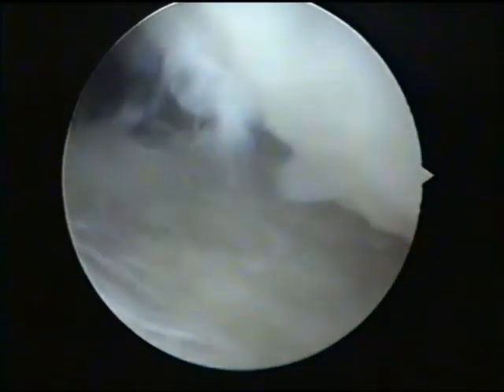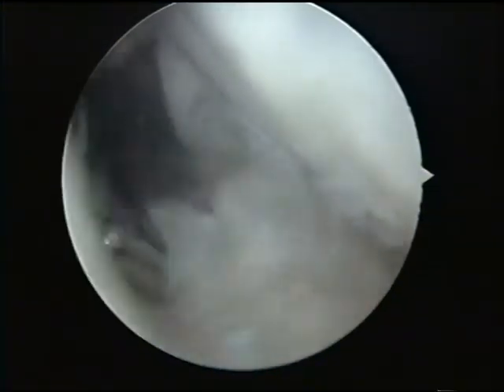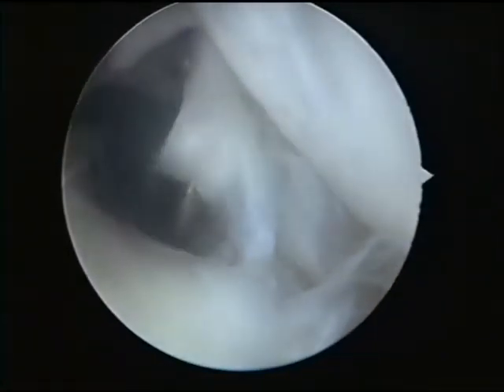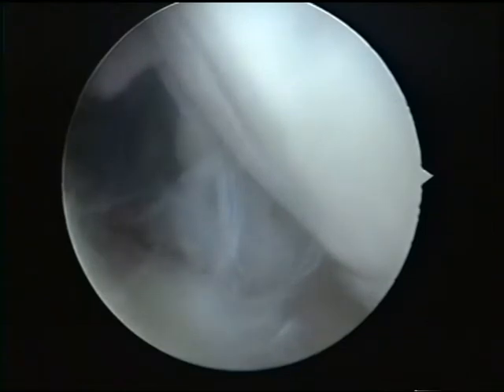Tear there. This is arthritis. And you can see it down here on the glenoid as well. The anterior labrum is torn. Looks like you have some damage to the supraspinatus tendon right here, which is part of the rotator cuff. So far, this shoulder is looking worse than the other side. Hold the blue, please.